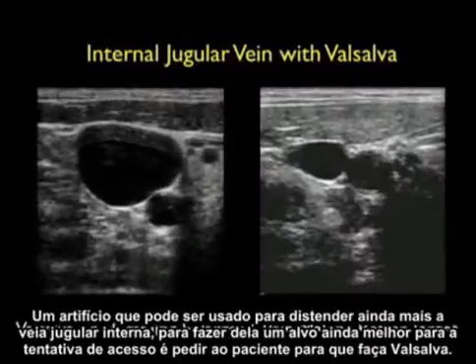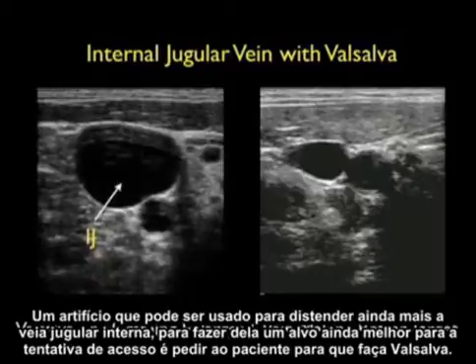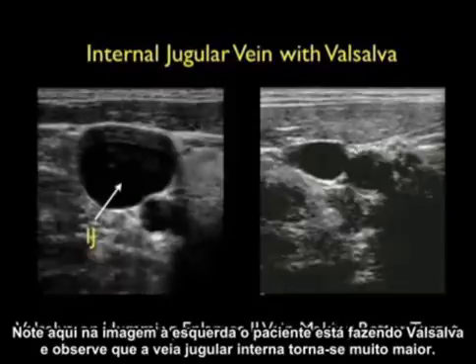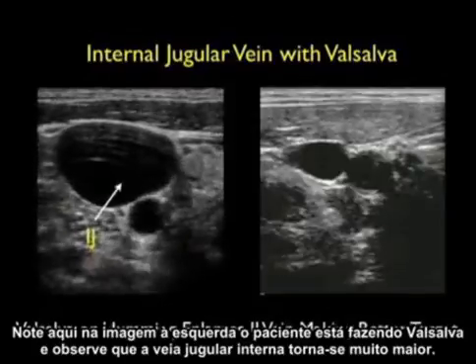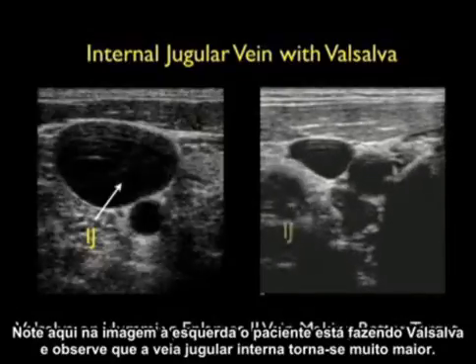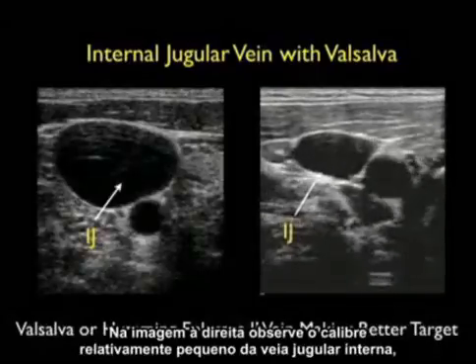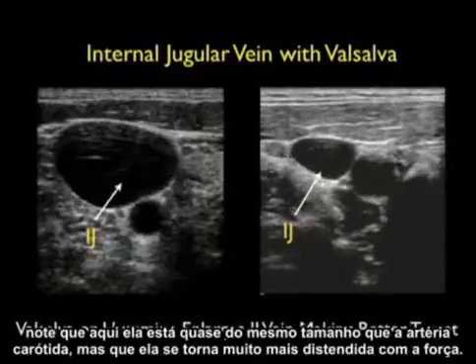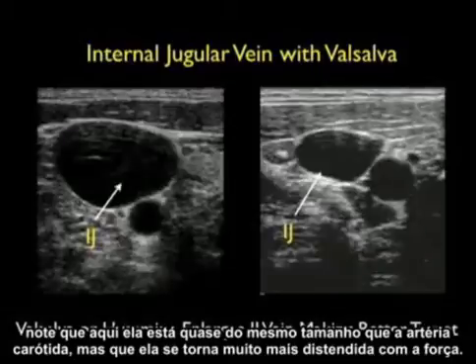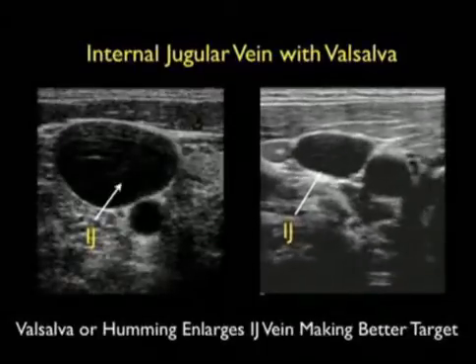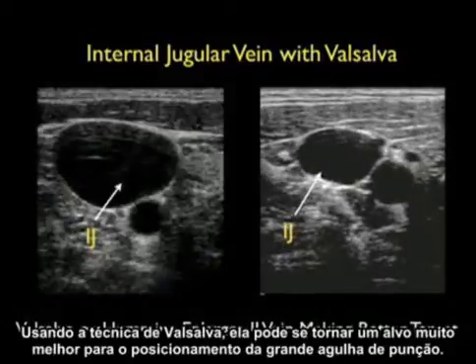One pearl that can be used to further distend the internal jugular vein and make it a better target for cannulation is to have the patient valsalva or hum. Notice in the image to the left the patient is bearing down and the internal jugular vein becomes much bigger. In the image to the right, note the relatively small caliber of the internal jugular vein — it's almost as big as the carotid artery at rest, but becomes much more distended as the patient bears down. Using the Valsalva technique can make it a much better target for placement of the large cannulation needle.